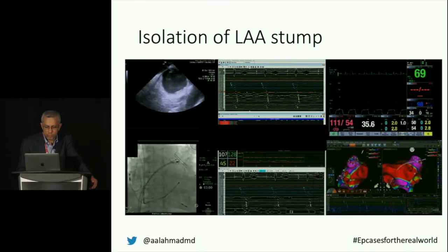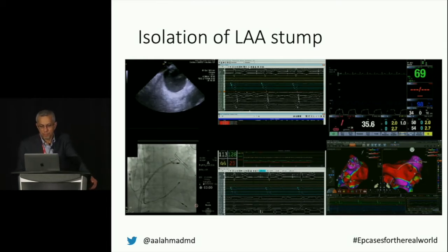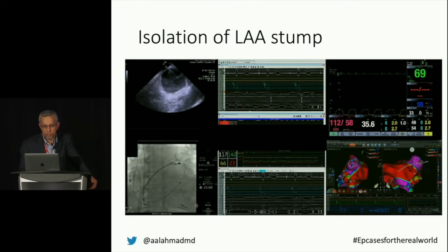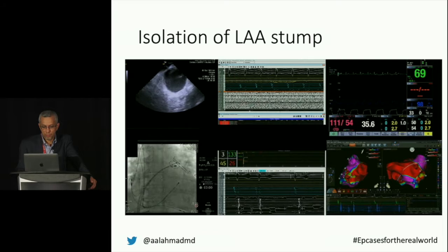It's kind of like a pulmonary vein. Once it isolates, the signal disappears. There it goes, disappears. And so the issue is this tissue is difficult to ablate, and the recurrence rates are relatively high. So one procedure doesn't always do it. As you saw with that previous patient, he needed 2 ablations, and even then didn't have an isolation.